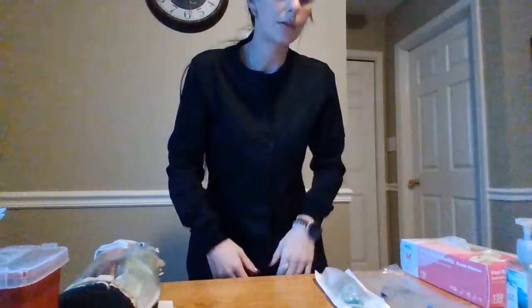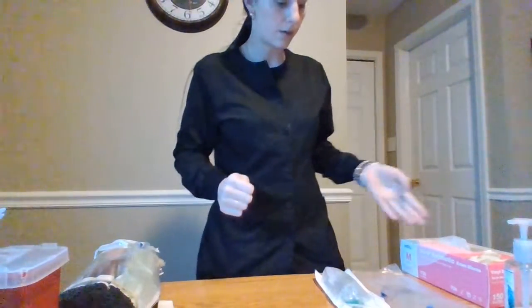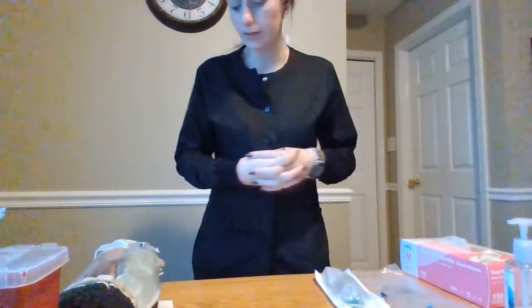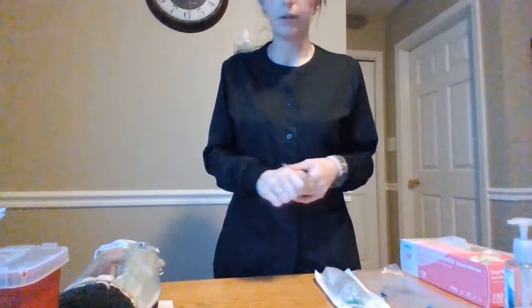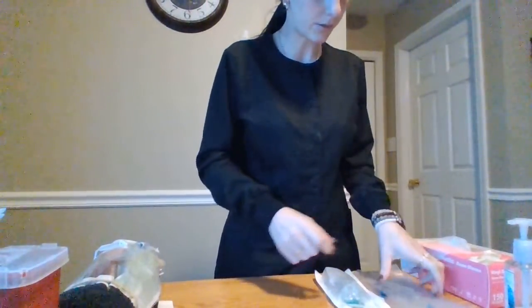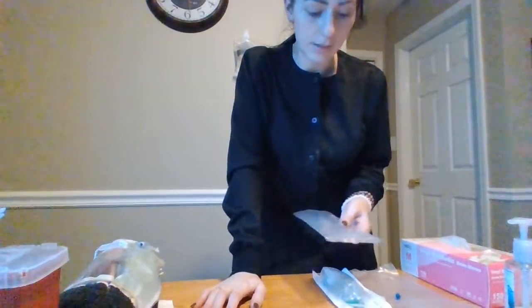We're giving this for a urinary tract infection. As we said, she has no allergies, so we're going to do our hand hygiene, and we're going to make sure that we have everything we need. We have gloves, medication, the lining for the secondary tube lining. I have my primary line already started, and my medication administration record here. We already provided privacy by closing the curtain, and now we are just going to check the bag that we're giving to make sure that it lines up with the MAR.